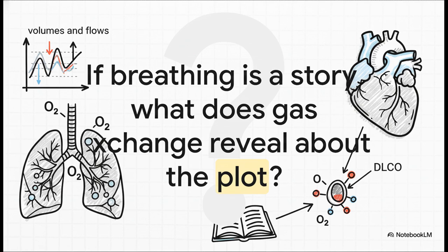You can see how this whole framework lets us read the lungs with remarkable precision, but it leaves us with one final thought. If spirometry tells us the story of the mechanics, the plot of how we breathe, then the DLCO reveals the story's deeper meaning. It gets to the very heart of the lung's ultimate job, the efficiency of gas exchange. And to really understand a patient's whole story, you absolutely need to integrate both.